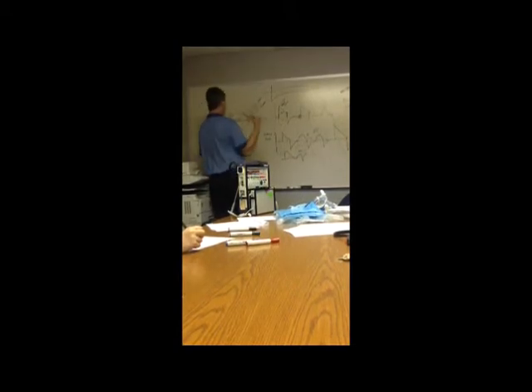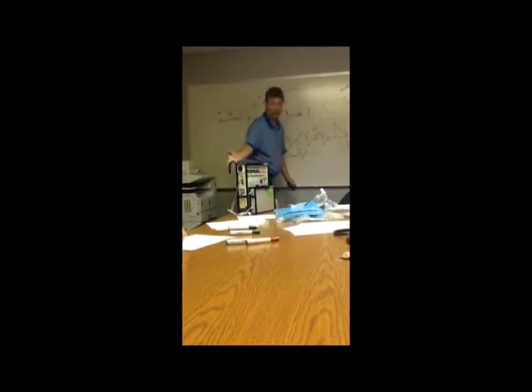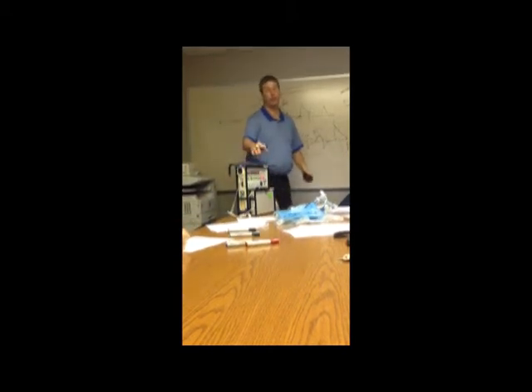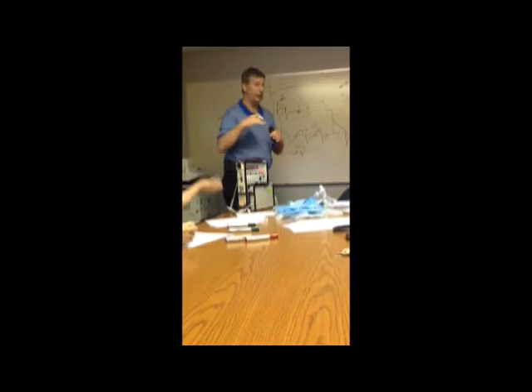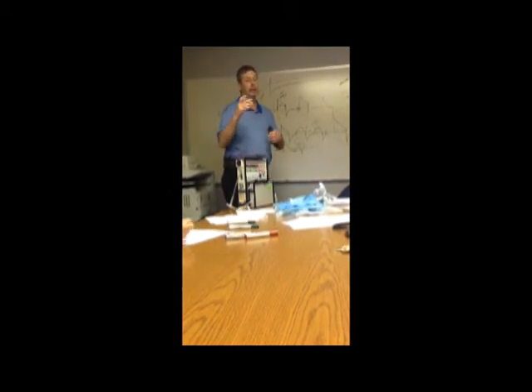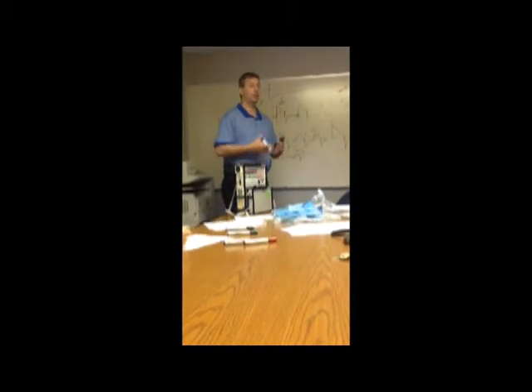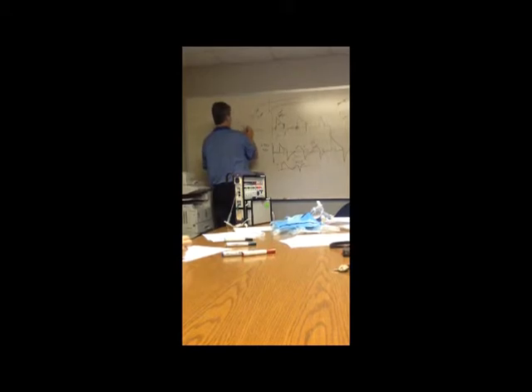On our machines, it's like this. On your machines, when you dial in 20 of IPAP, or whatever you call it on this one, when you dial in your pressure support, that's the key. If it's called pressure support, it is above the PEEP. It means you add it to the PEEP. If it's called IPAP, you subtract the PEEP out of it, and either one of those gives you what pressure is applied when they breathe in.